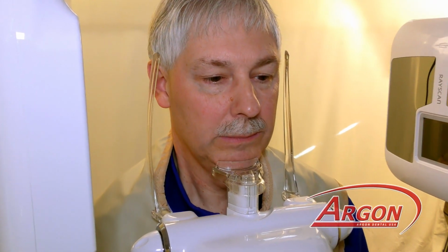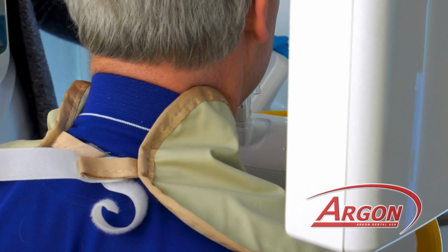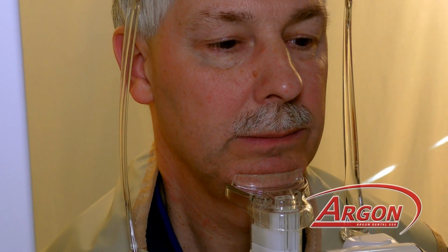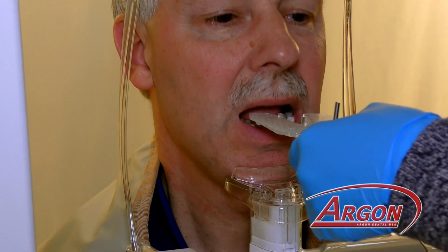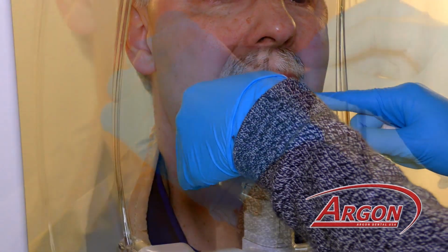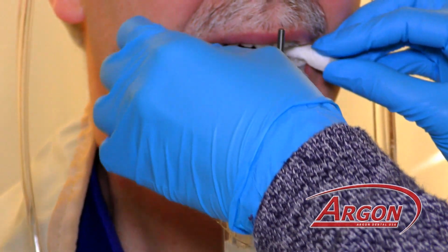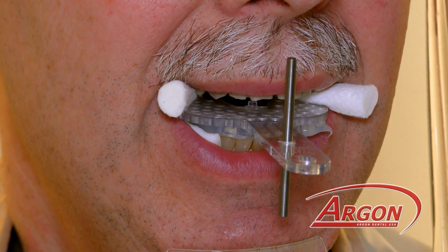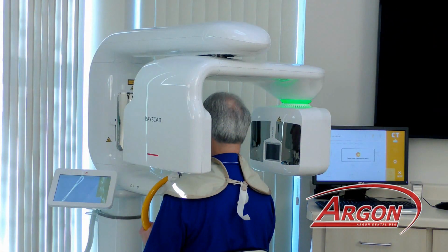Patient is positioned in the chin rest. Adjust the height of the scanner accordingly and install the scan solutions guide, making sure it is fully seated on the patient's teeth. We still use cotton rolls to separate the two arches and perform the CT scan.